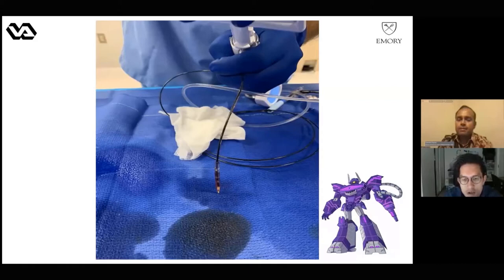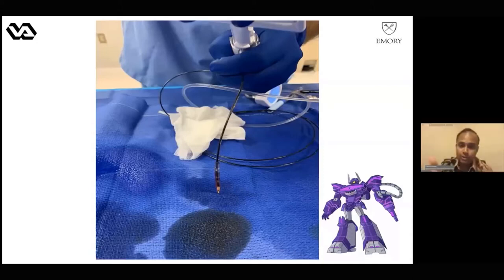But then I have a short question. When you see the rupture or the extension of the hematoma, do you think it's due to the shockwave that was given, or due to the hydraulic pressure when you rupture the balloon? What do you think? Perfect. We'll talk about it in a second. There are a number of different mechanisms for this. There are a couple of different possibilities. Yes, it can be due to the hydraulic jet. As you can see, you have a nice little hydraulic jet here. Our balloon rupture happened at 2 atmospheres. We never made it to 3 atmospheres.